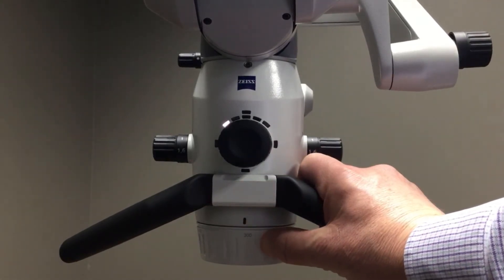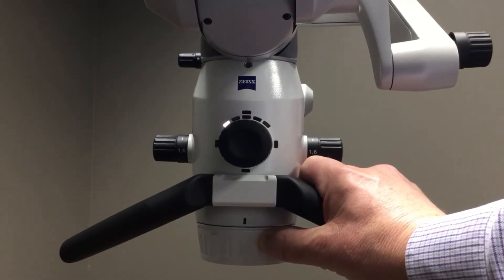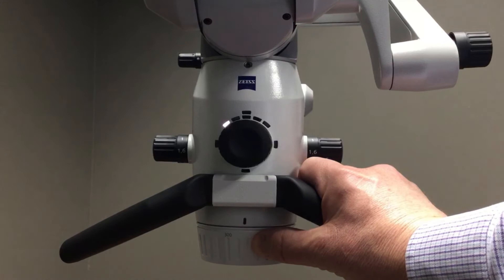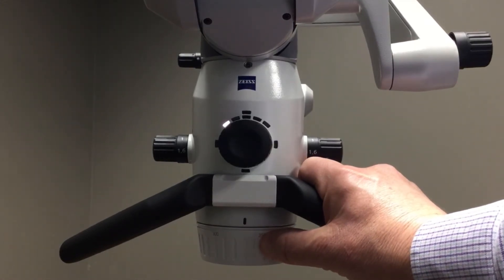For my fine focus adjustment, I simply move my thumb down to the dial, and there I can easily move and get that fine focus in the right position for my procedure.